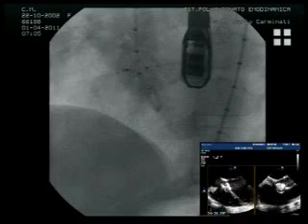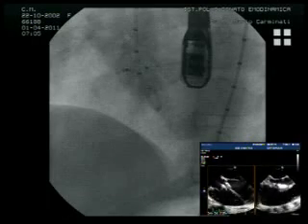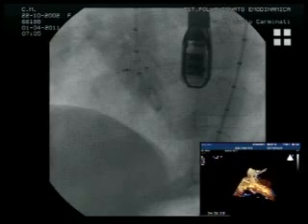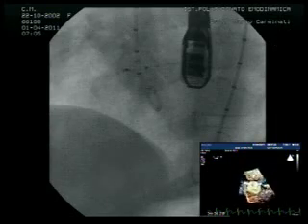John Thompson's got a question. Mario and Kevin, can I ask you whether you think the risk of heart block is any less in these patients with a muscular margin as opposed to the true perimembranous defects? Okay, we will reply separately. Kevin, what do you think? I think less, but not non-existent.